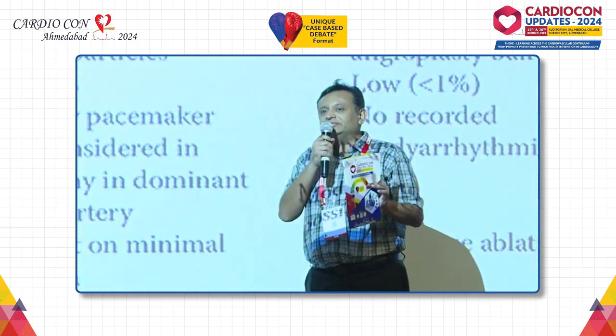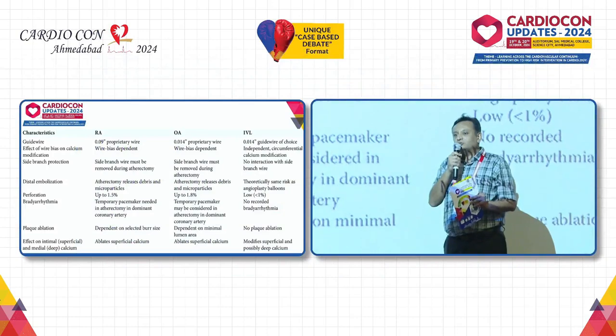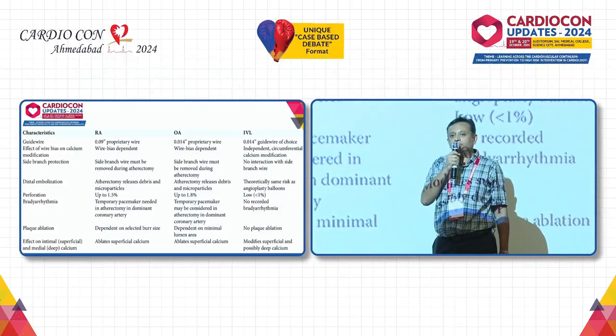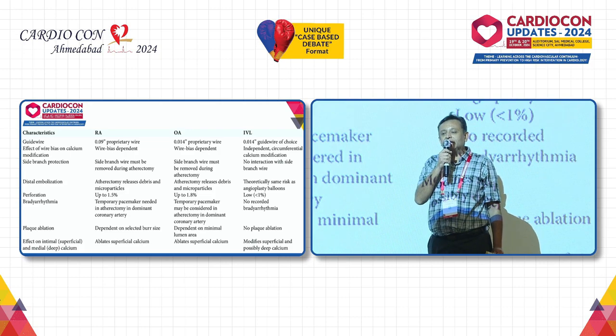The first take-home message is calcium is the enemy, so we have to break the calcium or soften the calcium or drill the calcium before implanting a stent for better long-term prognosis. If we put the stent before breaking the calcium, then the risk of ISR and stent thrombosis is very high.